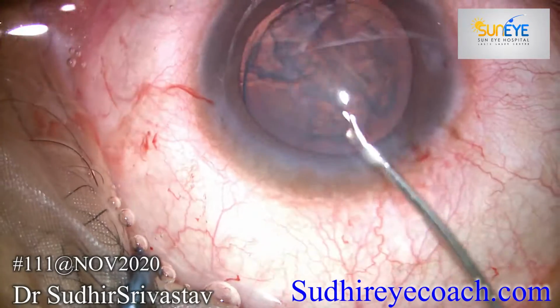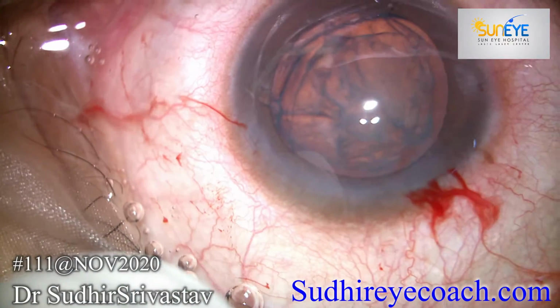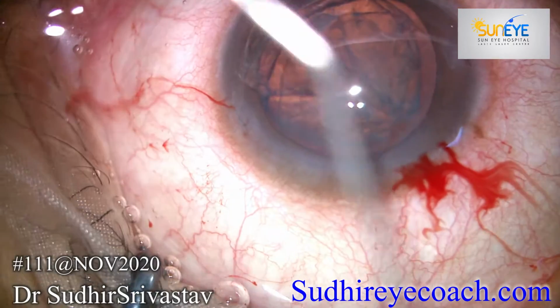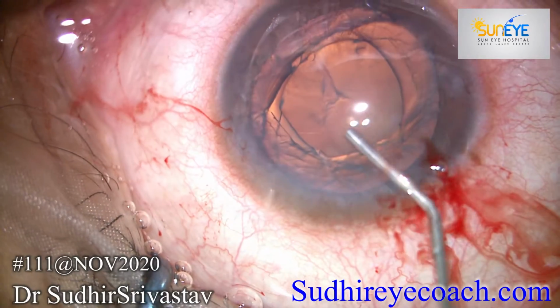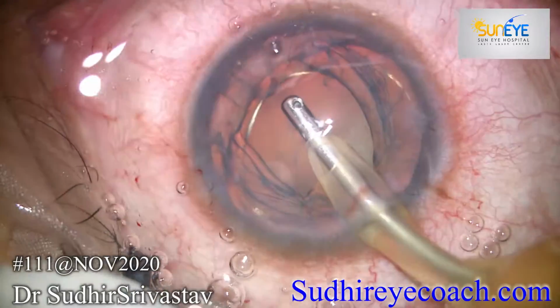Good hydro procedures are always very helpful. Always try to do good hydrodelineation and hydrodissection. In this patient, the nucleus was not formed, so I decided to remove the nucleus with the irrigation and aspiration cannula.